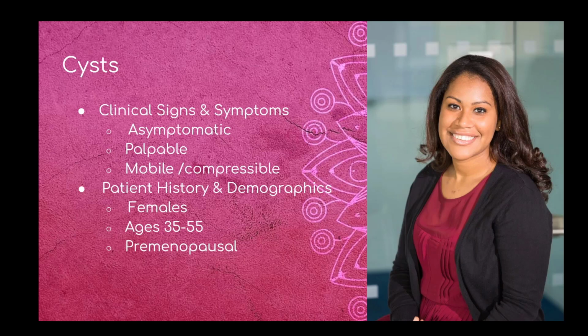So again, the benign breast pathologies, I do want you to know a little bit more about. I want you to know the family history, what the patient is feeling clinically, and then what it looks like by ultrasound. And then again, as you see, when we get to malignant pathologies, you'll just have examples and pictures of the different malignancies.